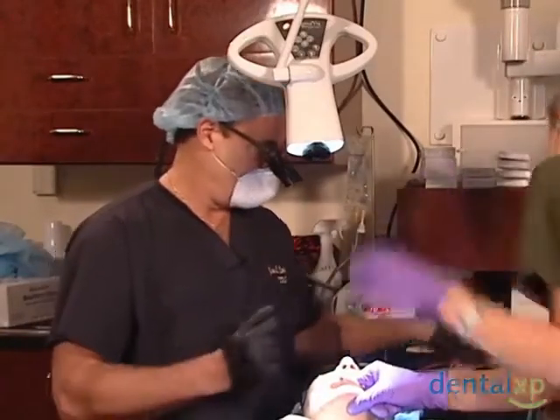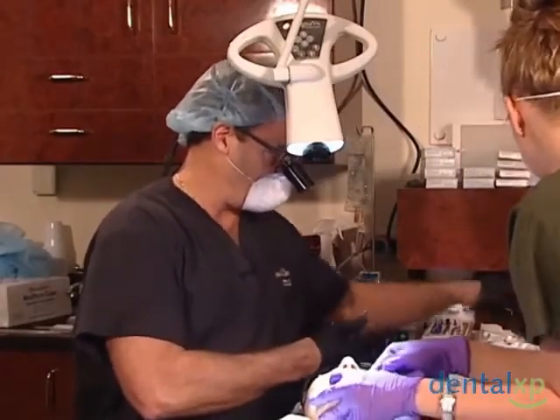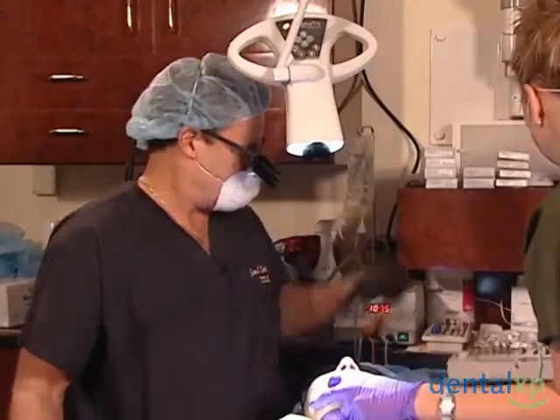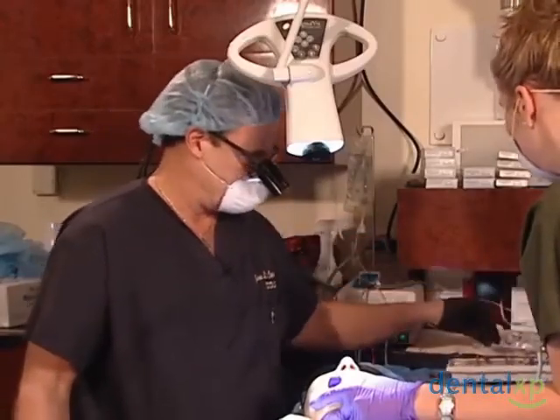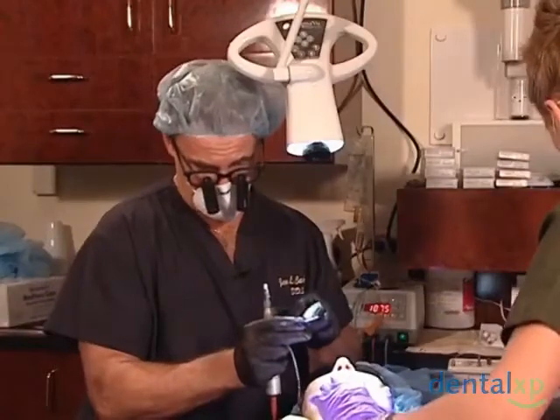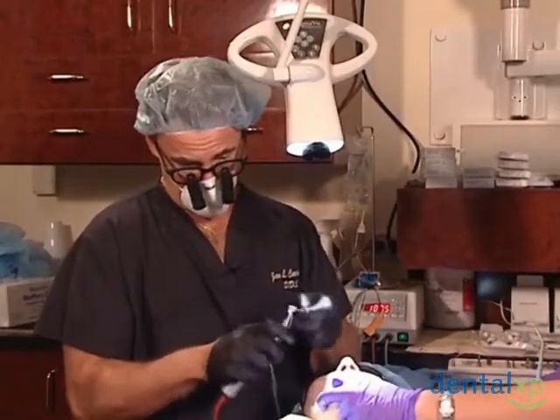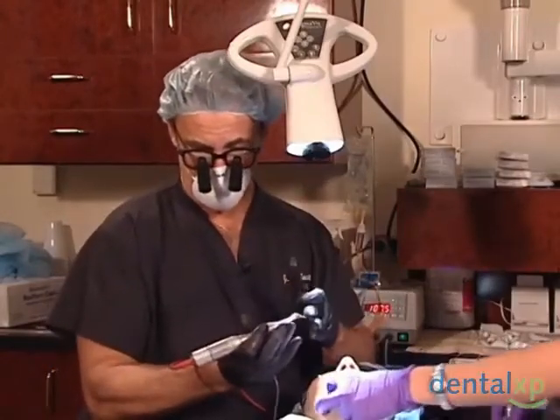Now I'm going to go back and just make sure that I'm at the depth I want to be. In your kit you have a 1.6 burr that has lines from 8 to 15 millimeters. It's easier to see these lines when it's rotating than if I have it stationary. Since we're at 15 millimeters, I'm just going to go back down in those areas to verify I'm at length in this bone, because the 2.2 implant will still have to tap itself.